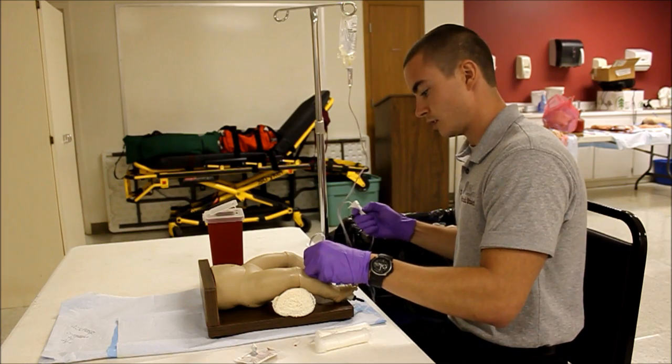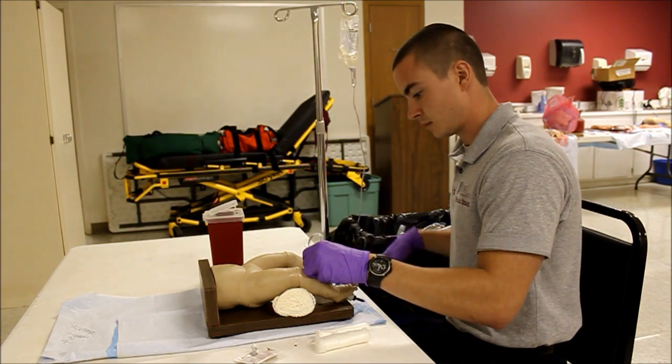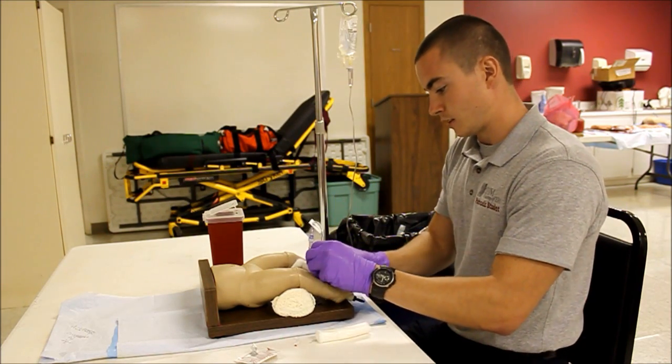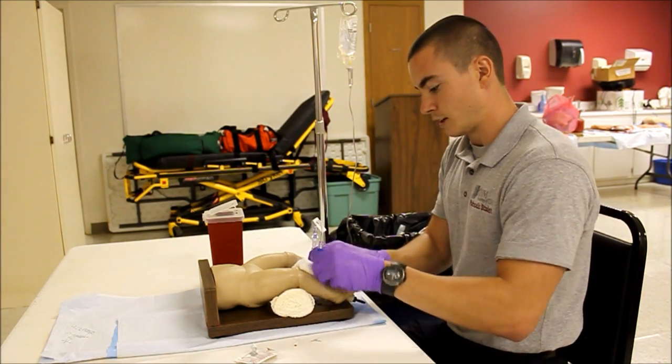Once I can see that my line is flowing, I'm going to go ahead and adjust it to TKO. At this point I'm going to go ahead and stabilize my needle, still making sure not to let go of it.